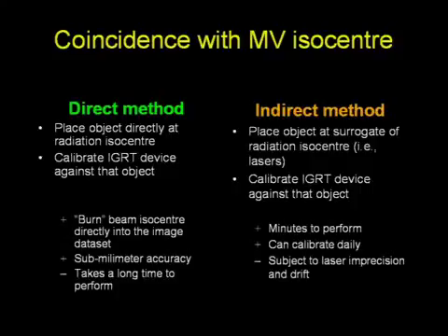However, this method is subject to laser imprecision and drift. As you all know from the AAPM TG40, the expected accuracy of treatment room lasers is of the order of 2 millimeters, and it has been our experience back at the hospital that this is the type of accuracy that we achieve using daily testing using the indirect method.